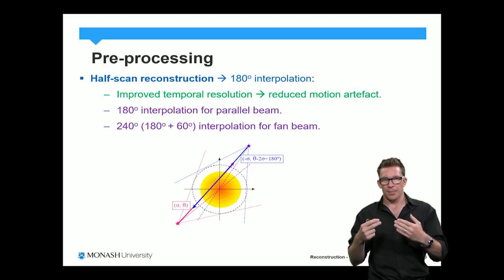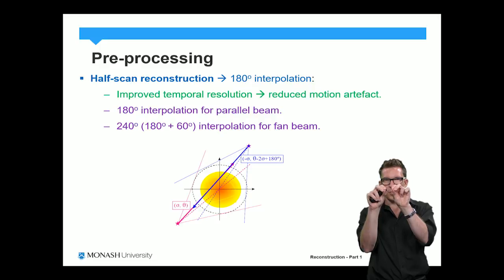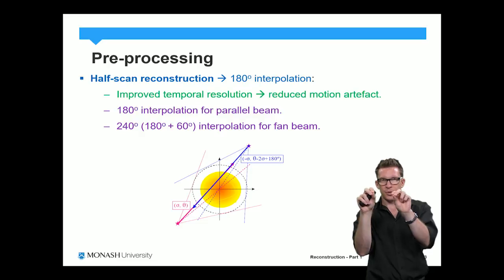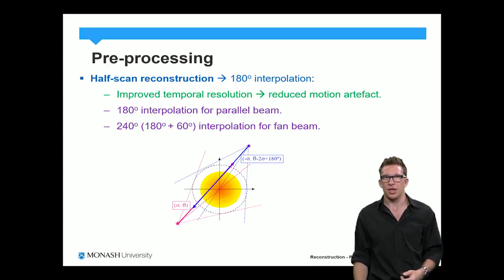So in interpolation, if I know I've got to interpolate the data, what I really want to do is have 2 points very close to and either side of the data point that I want to generate synthetically. So if I've got bone and I want to generate a point in the middle which I know is going to be bone, then if I take a weighted average between the value for bone and the value for bone, I'm going to get back the value for bone. So in general, having data points closer together in the CT reconstruction process means the interpolation is more accurate.